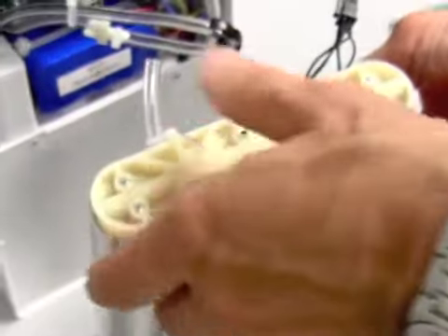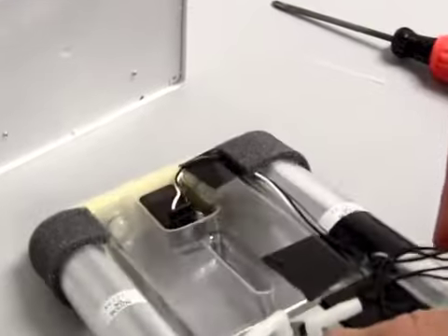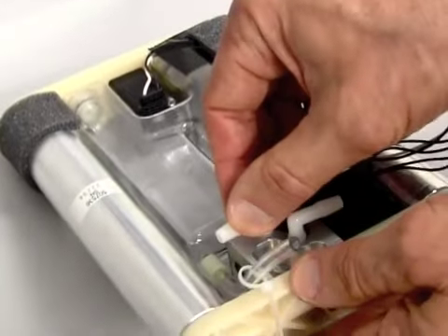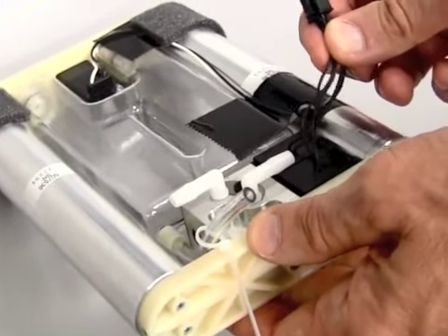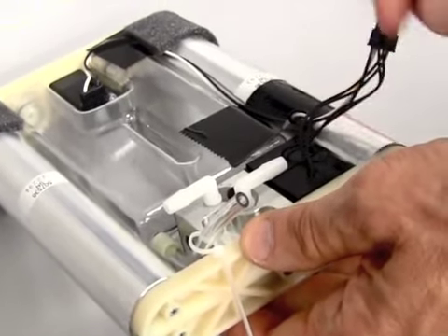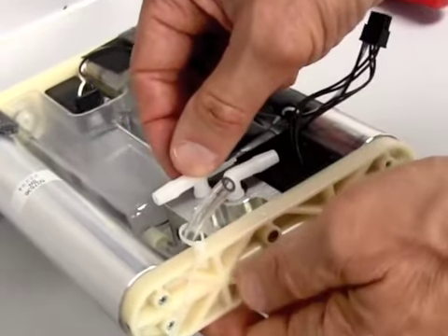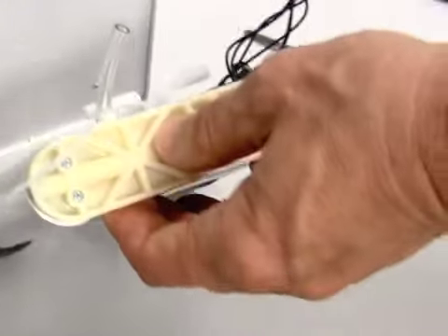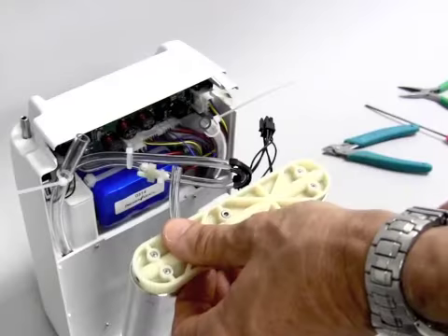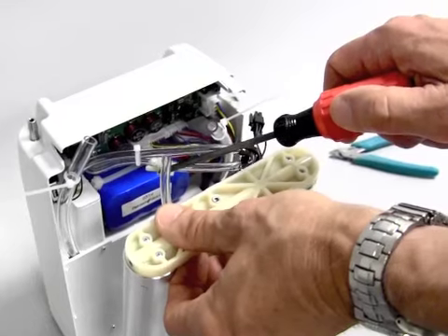To reinstall the sieve bed assembly, what you've got to do is put the Tygon tubing back onto the ports on the sieve bed. It's important to note that you watch the nipples that are sticking out, and the one that is closest to the wire where the plug goes into the circuit board should be the high one when you're looking at it, and the other side or the left side should be the low one. Now what you want to do is install these back onto the Tygon, and then the small Tygon tubing goes back onto the filter assembly.